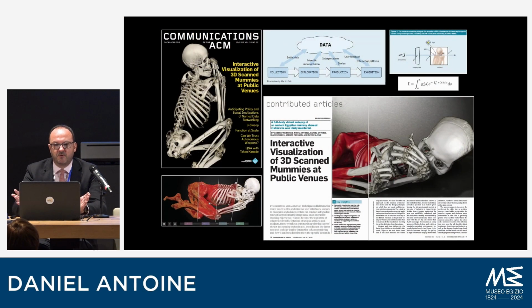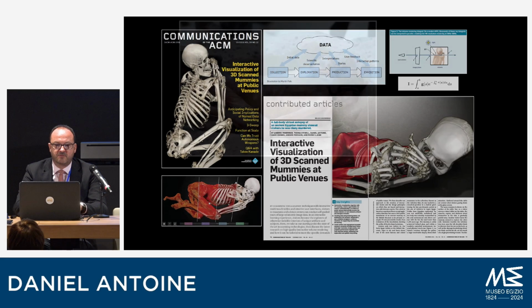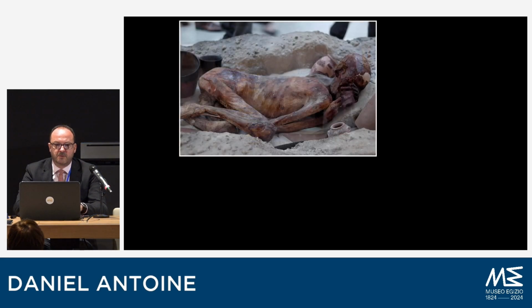So if you want to find out more, especially about the mathematics used, the public has access to the full CT scan data, and we do rendering in real time. So we used a Swedish company that does very complicated live rendering, but also we put all the public research in that paper. So if you want to find out more, do so.